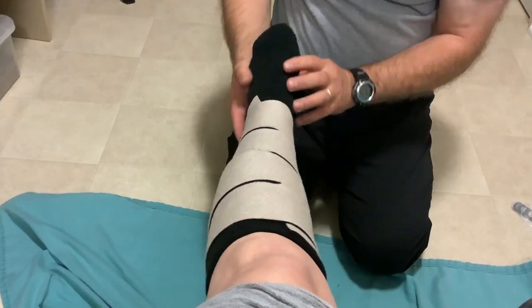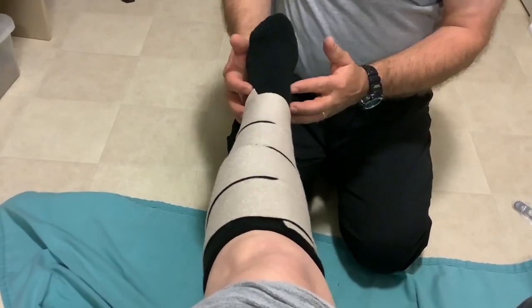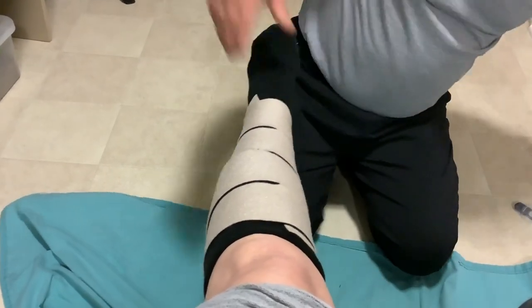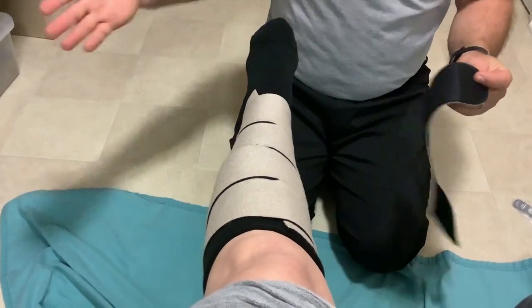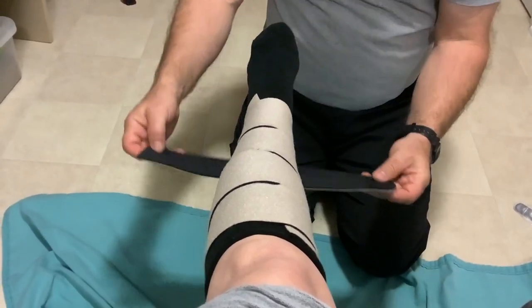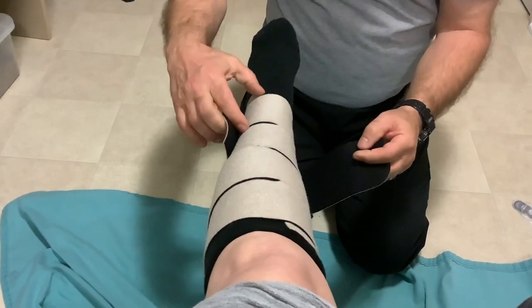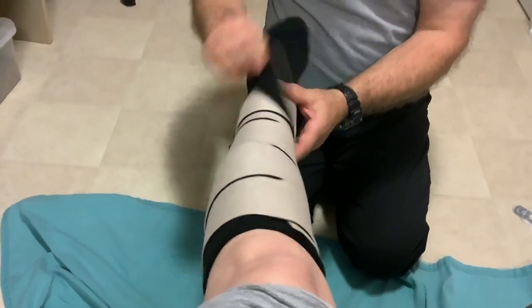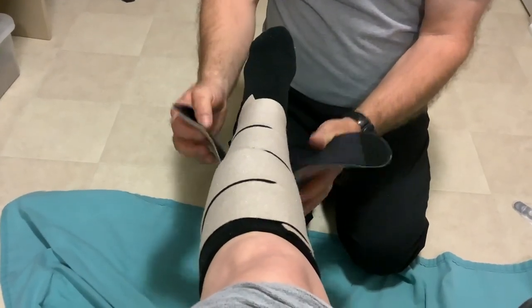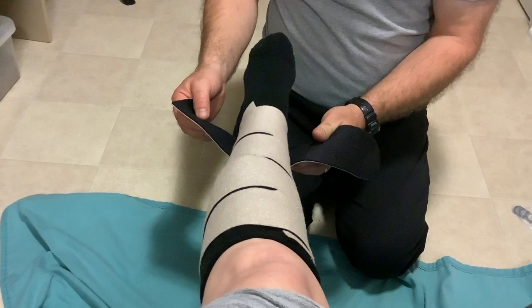If you have somebody with a longer leg, you can purchase a Velcro extension tab. It comes as a really long tab and you just cut it to size. If you need an extra layer, it's the same width as all the other straps — simply pull it around, snug it up, and check pressures as well. It gives you an extra extension without making it custom.